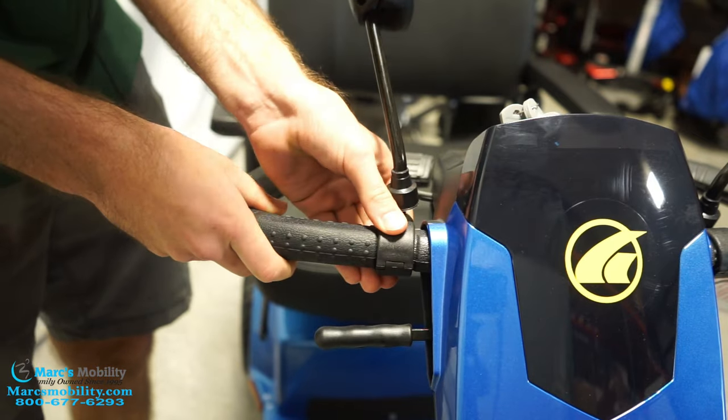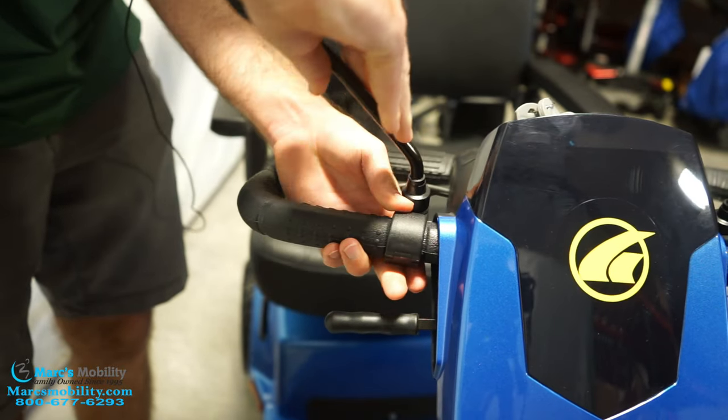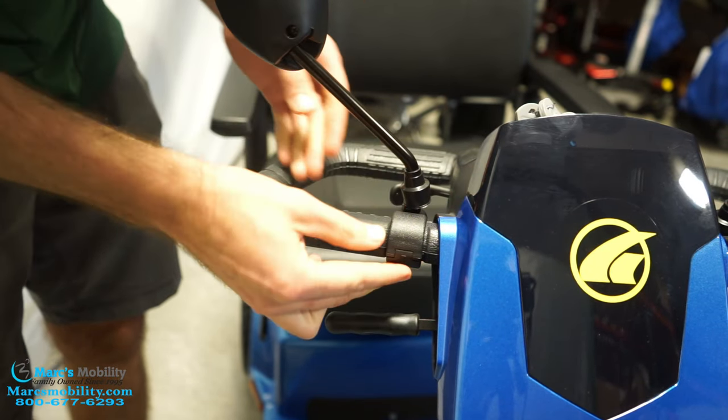You can adjust the tilt as well. Once you get it where you want it, just keep spinning, and eventually it will tighten up. Then you will have your mirrors mounted.